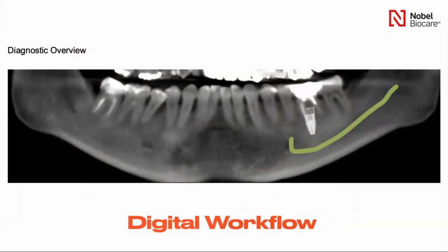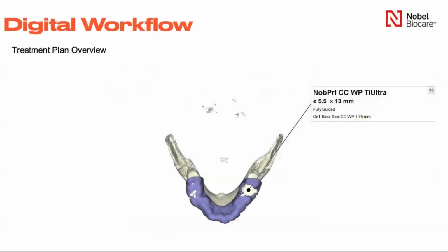And then if we have to remove this tooth, which we did in this particular case, we can now treatment plan the case through a digital workflow. We can map out where the nerve is. We can plan our implant in advance. We can decide how many implants we want, which is one.